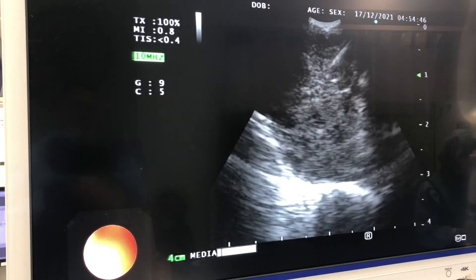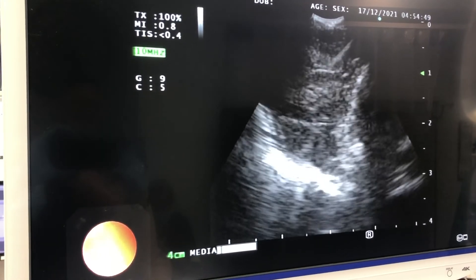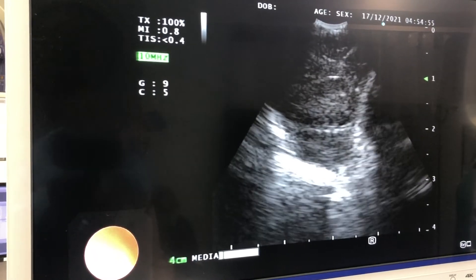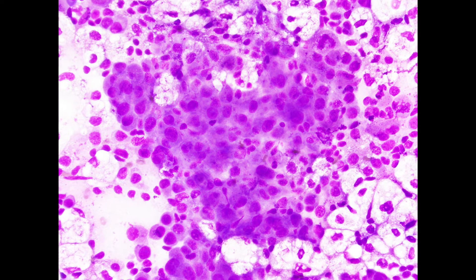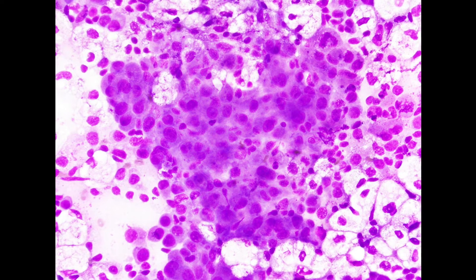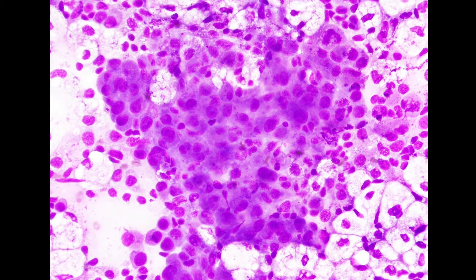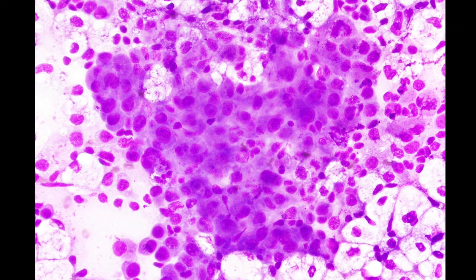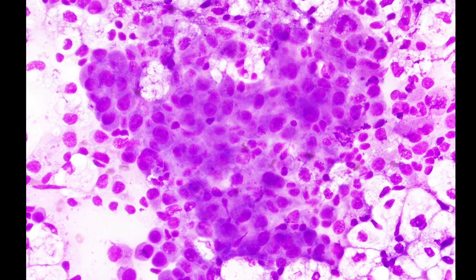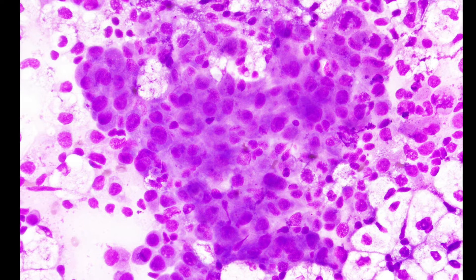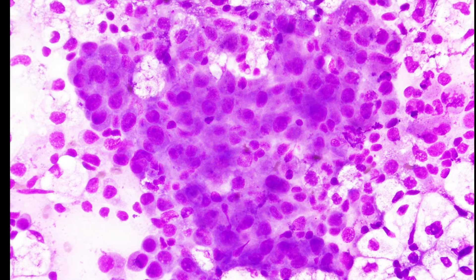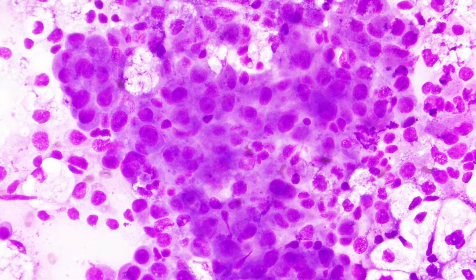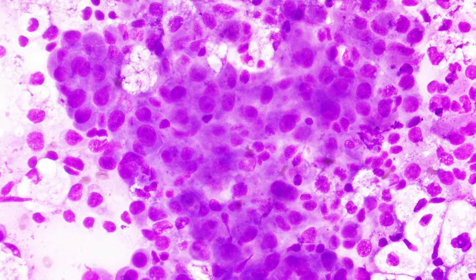We can now biopsy this quite easily — you can see the needle going in straight into the lesion under ultrasound guidance. Once the stylet is clear we can needle the lesion and get a good sample to send off for cytology. This is the biopsy showing highly abnormal tumor cells of mesothelial origin. The cells show mitotic figures — tumor cells that are actively dividing — which is a sign of high malignancy. Immunohistochemical stains confirm these cells are mesothelial in origin and not from a lung cancer or something else. This confirms an epithelioid mesothelioma, which in the correct clinical setting is diagnostic.